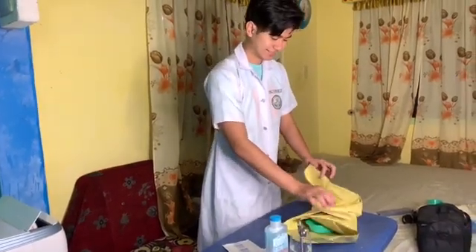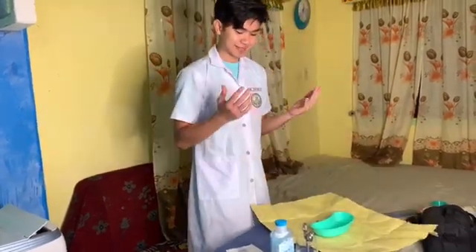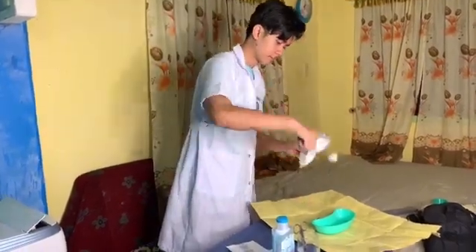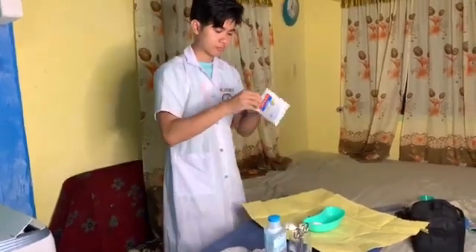Using aseptic technique, open the sterile dressings and supplies on the work area. Supplies should be within easy reach to maintain sterility. Open the sterile cleansing solution and pour it over. Pouring solutions over sterile dressing supports the principle of aseptic technique.